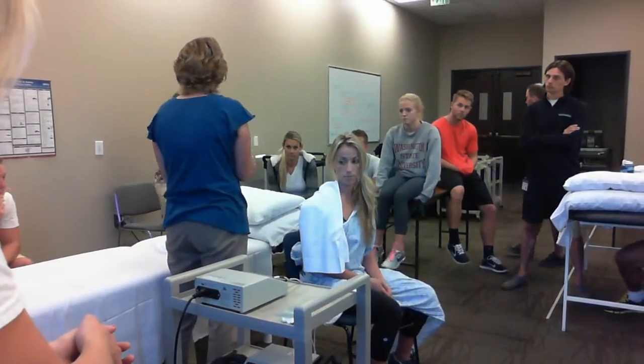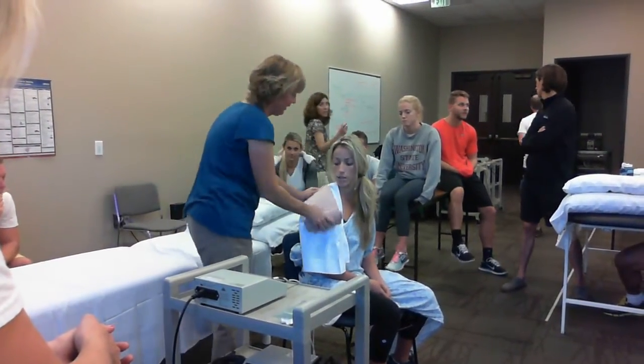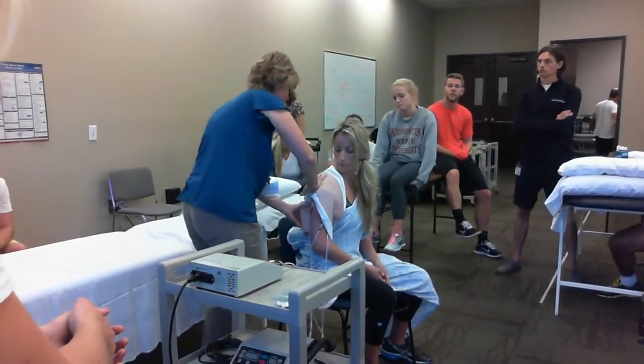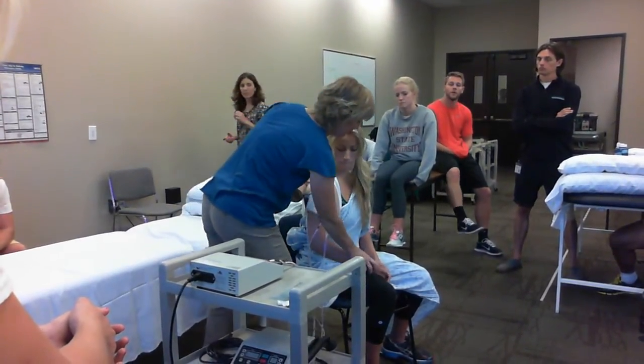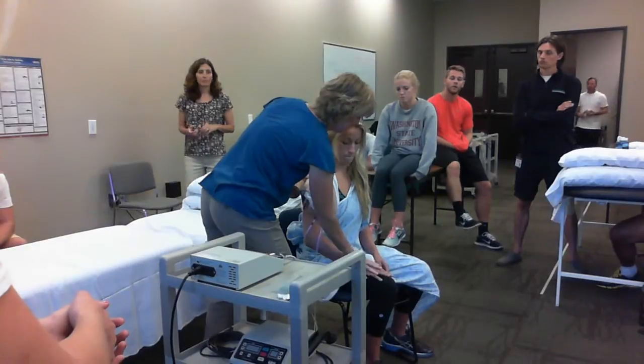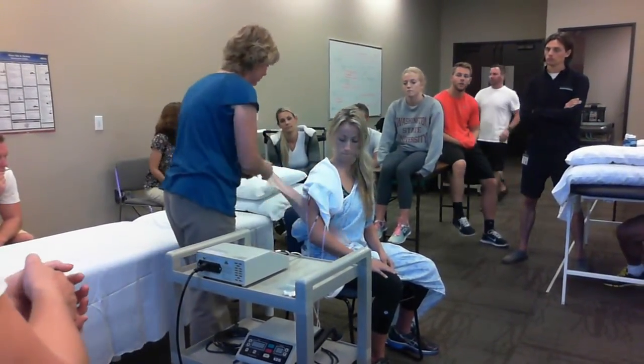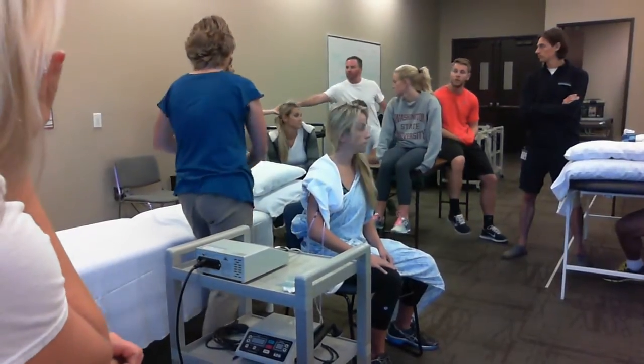Oh, you don't want the big one to wrap around. I'll do it, what the heck. She's so tiny, but okay. So I'll do my little wrapping technique. And she's a rotator cuff repair, so it's not as easy because she's not supposed to actively lift her arm. So, you want the smaller one? Yeah.